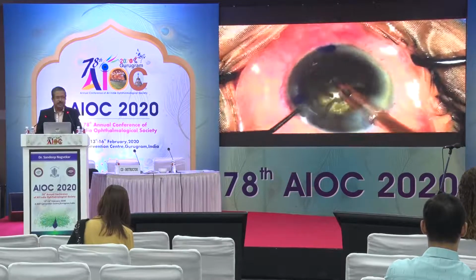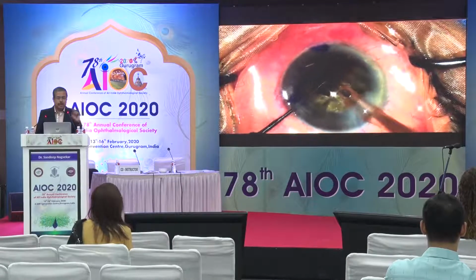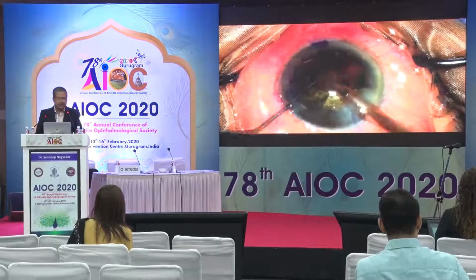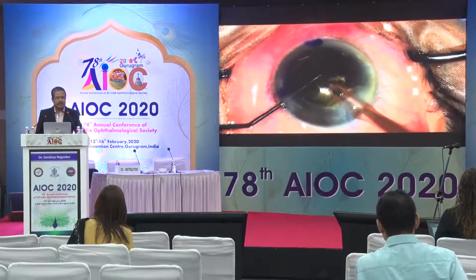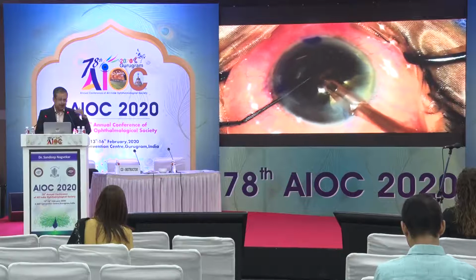And the second thing is that when you're using a combination of a torsional and a longitudinal, it also is useful to help the nucleus remain a little away from the phaco tip, because you need just the tip of the nucleus at the shearing plane. If you stuff too much, it's easy to clog the nucleus, and all the time you have to take the handpiece out to remove the clogged material. So you just bring it in and then keep it away.